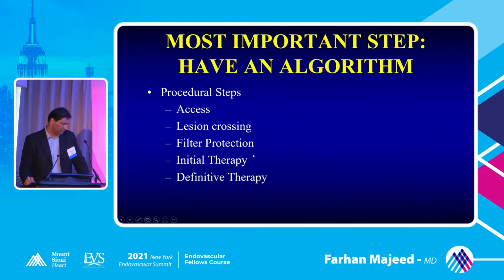Well, I think you got to choose your sheath per your device, right? So if you want to go with a Rotarex device, if you want to go with a JetStream, which is also indicated in ISR, if you want to go with a larger laser, especially the rotational laser that I know we didn't go over that data, you would have to choose a bigger sheath.